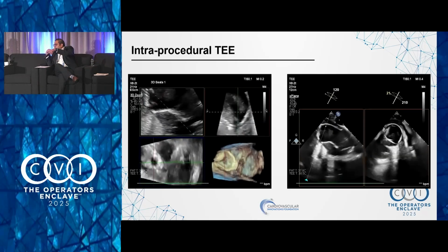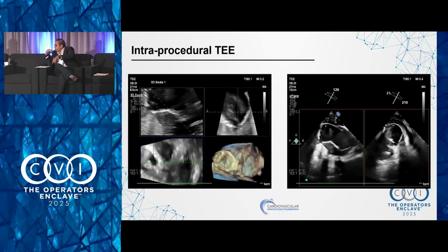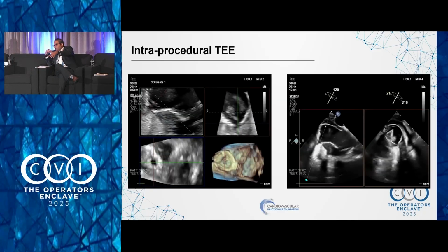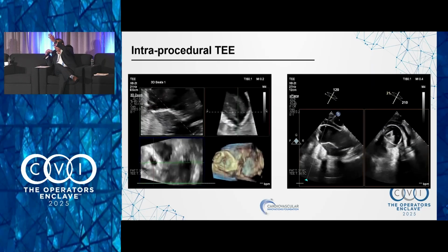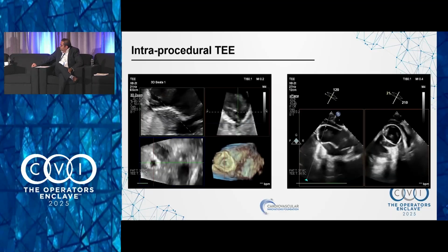But I would put the guide liner across that RCA, so you plug it and have the guide liner so that you don't struggle advancing the stent. So wire the coronary, guide liner, have the stent ready in the coronary, plug it with the other guide, and then on the way back just stent it. Yeah, I would do the same.